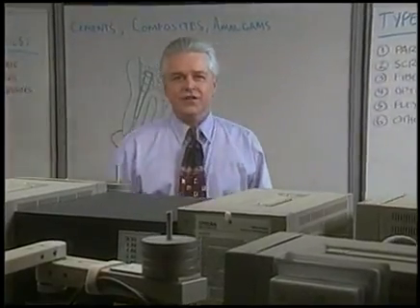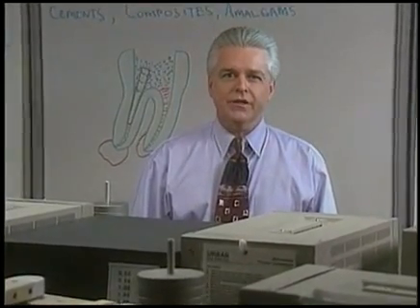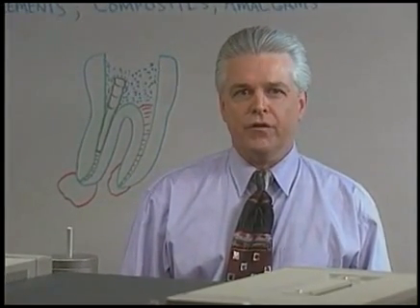Recently, there's been a renaissance in our approach to endodontic retreatment. The great news is we can generally, non-surgically remove posts and broken instruments with today's technology. Hi, welcome to Endodontic Retreatment. Today we're going to focus on the non-surgical removal of posts and, a little later, broken instruments.